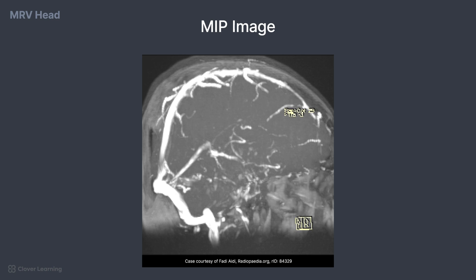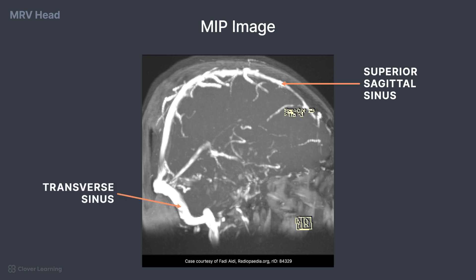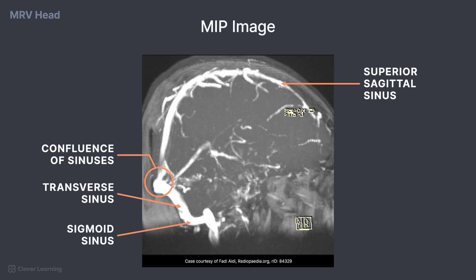MRV scans demonstrate the venous drainage of the head, occurring in the venous sinuses. These sinuses are located between the endosteum and the meningeal dura, or between the layers of the dura mater. These channels do not contain valves like other veins in the body. In this image, the superior sagittal sinus is demonstrated as the most superior bright signal. The transverse sinus can be seen emerging laterally from the confluence of sinuses, which is where the superior sagittal and transverse sinuses meet. The sigmoid sinus is located more inferiorly and is named due to its S-shaped appearance. The straight sinus is located in the line of the junction of the falx cerebri and the tentorium cerebelli.